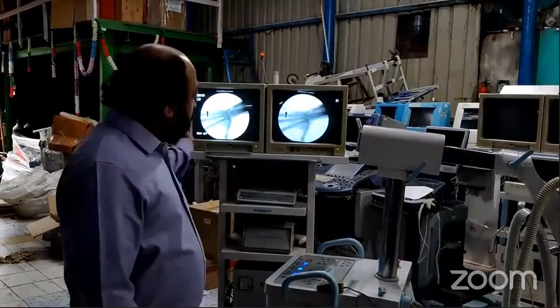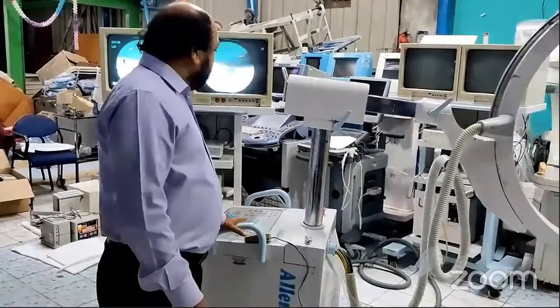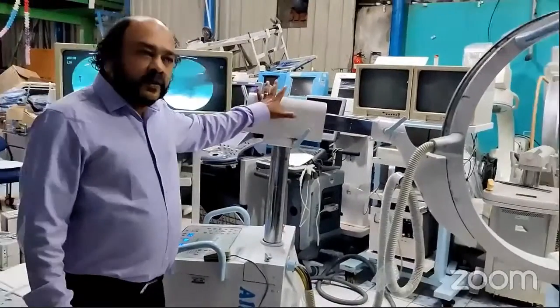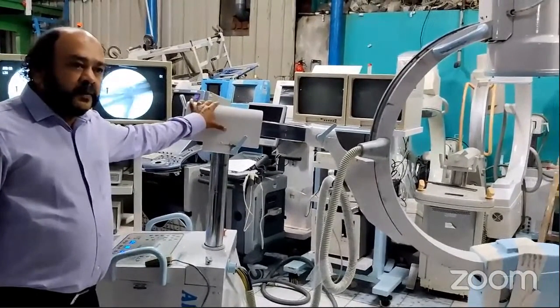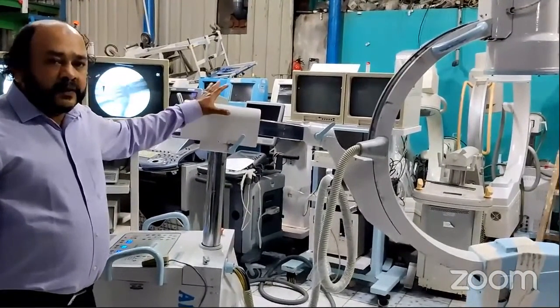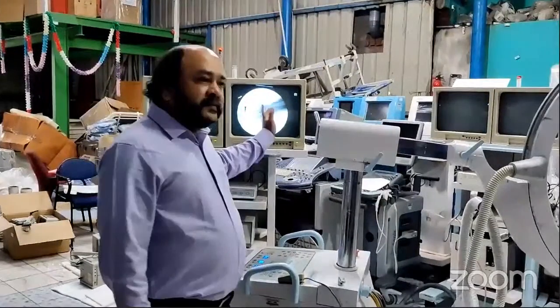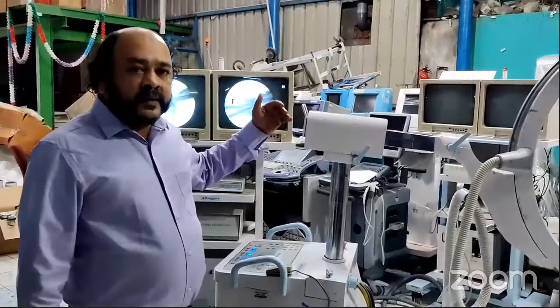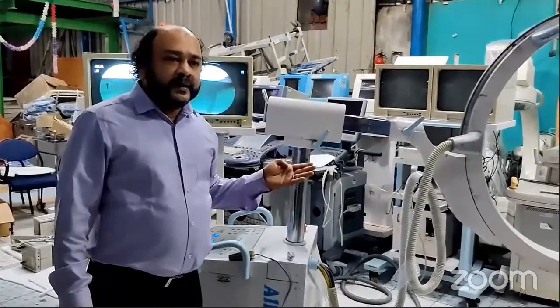Before that, I will inform you, there are two parts in this C-arm. One is the C-arm, which is normally kept in the theaters, the OT, and this is the memory unit. Whatever image you take will be stored in the memory. So later on, after the surgery, you can recall the memory and go through it, to see what they fixed or not.